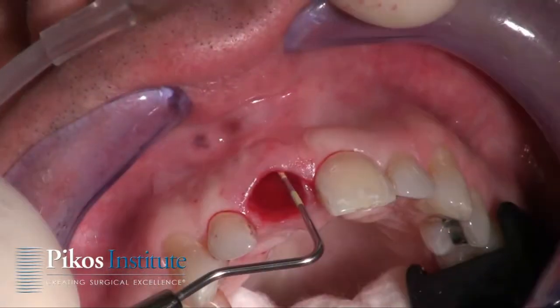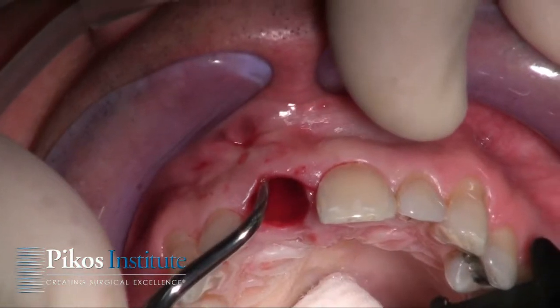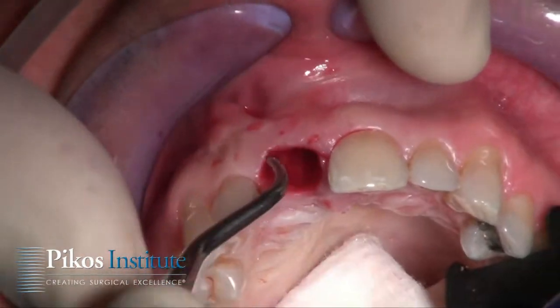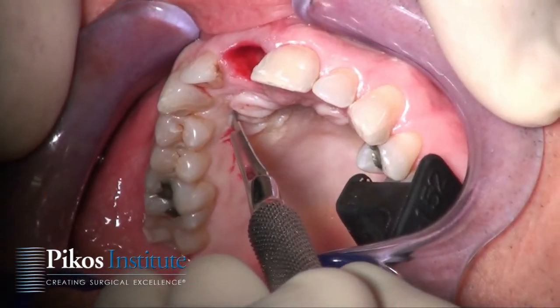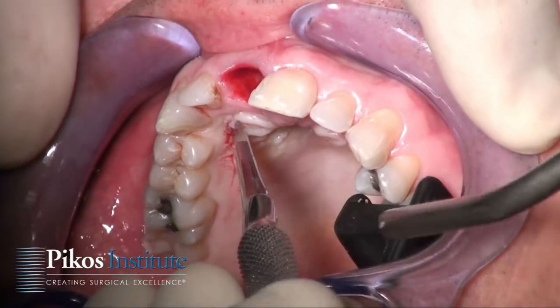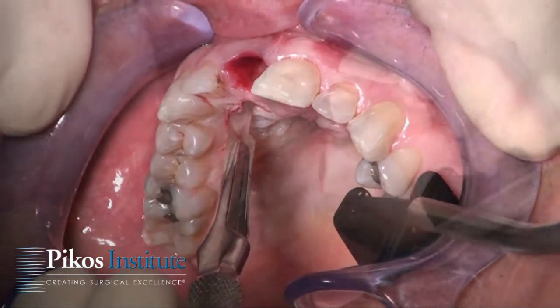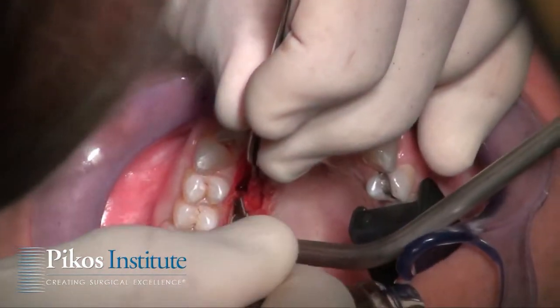So there's this patient — the socket's compromised. I'm just creating as much of a tissue pocket as I can because the periosteum, bone is gone. So you go deep enough to get some plane going. And then here's the hockey stick incision — it's coming across all the way opposite the socket. I'll try pedicle most of the time, but it ends up being a free sometimes because this thing is too thin up here.